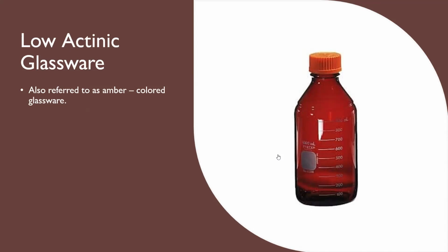Bilirubin is a product produced by our liver, wherein if you extracted the blood for the bilirubin determination, you have to take note and consider that bilirubin is photosensitive. Thus, if we are collecting blood for bilirubin determination, we are protecting the sample, the serum separator gel, from the light because of its characteristic of being photosensitive.